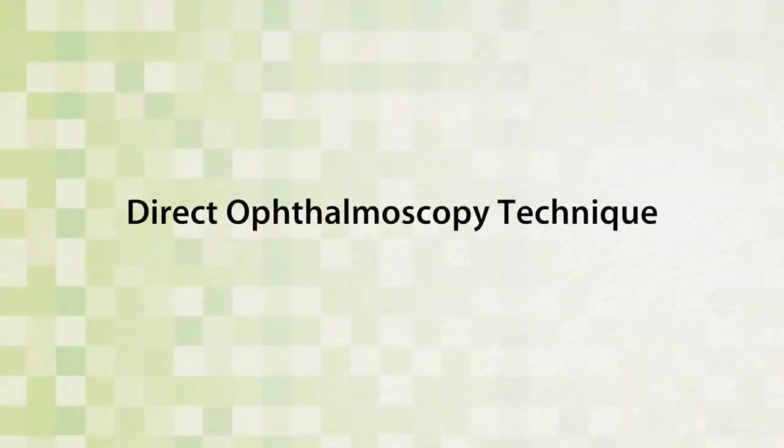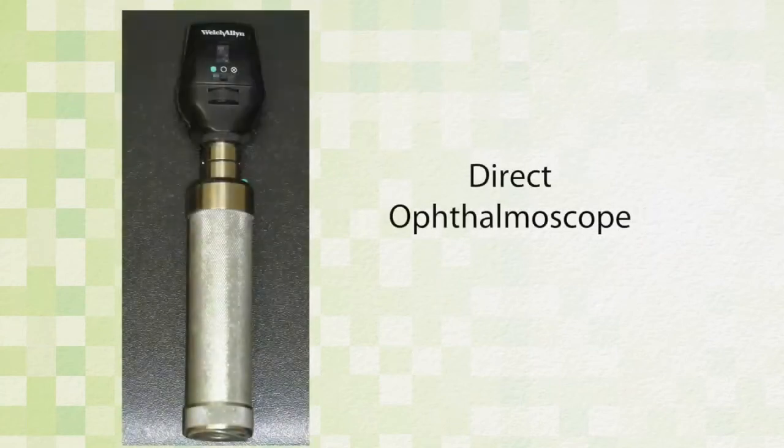Direct ophthalmoscopy technique. A direct ophthalmoscope consists of a power source whose light is directed via a mirror or prism into the animal's eye and then reflected back to the examiner through a lens in the ophthalmoscope. The resultant fundic image is direct, upright, and magnified approximately 8 to 25 times in our companion animal species.